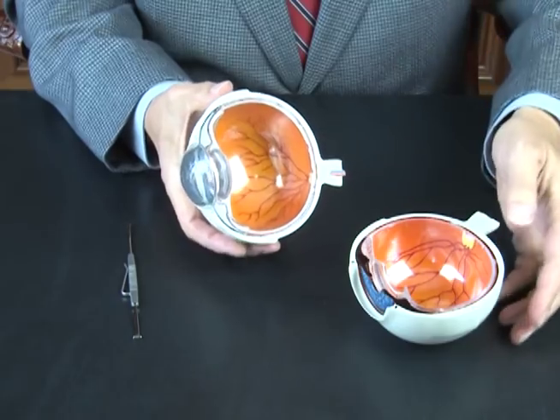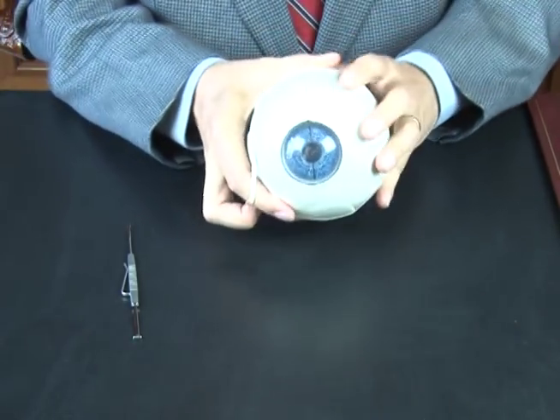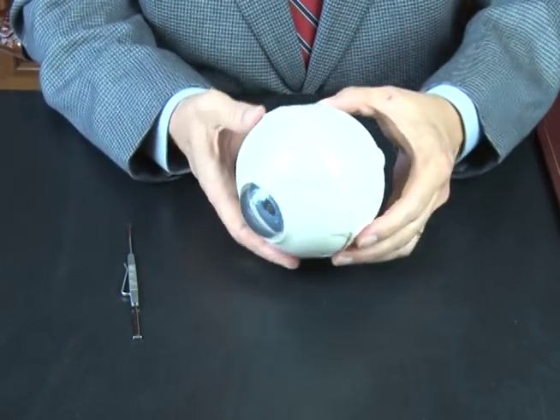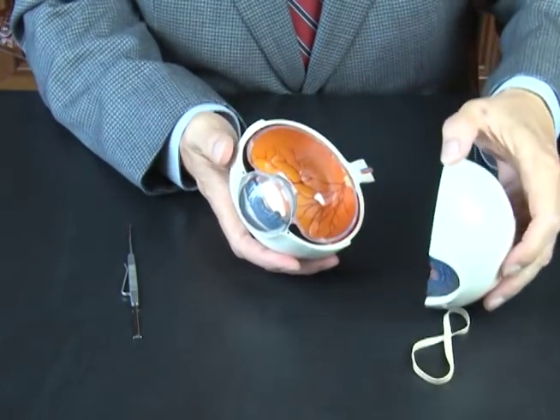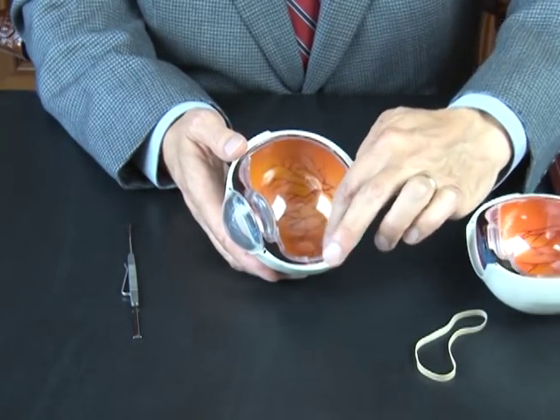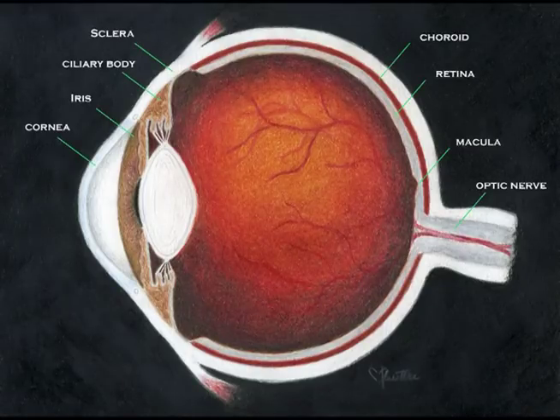One method to repair retinal detachment is called a scleral buckle surgery. In a scleral buckle surgery, a band or belt is placed around the eye, underneath the muscles, somewhat like this rubber band is around this eye model. The scleral buckle or belt creates a ledge of support internally, so the sclera slightly buckles in or indents, and that creates a ledge of support for the retina, allowing it to remain attached. Here is an artist's rendition of the eye as seen in cross-section with labels.